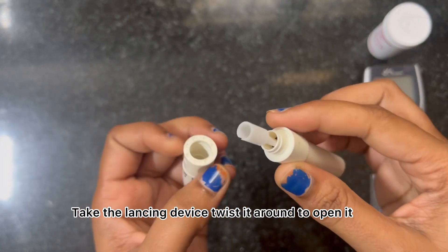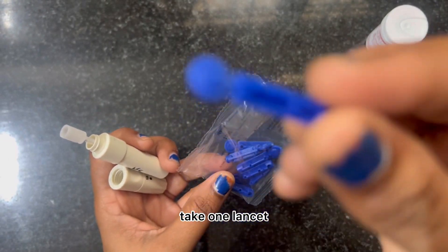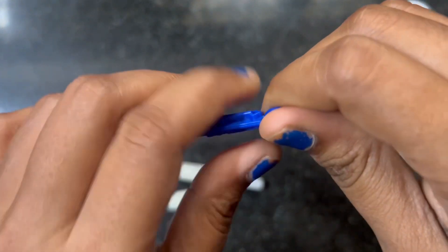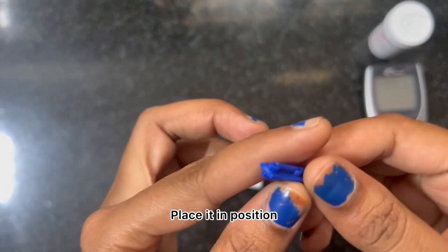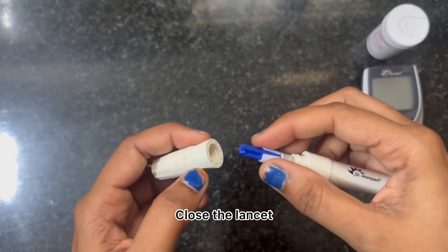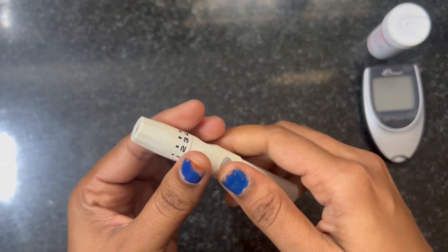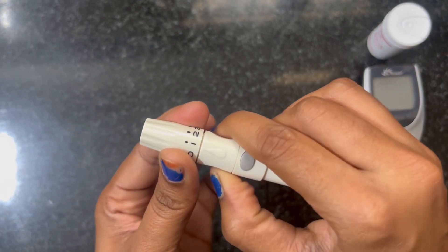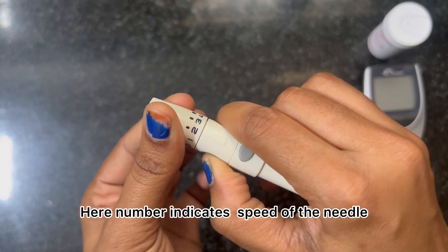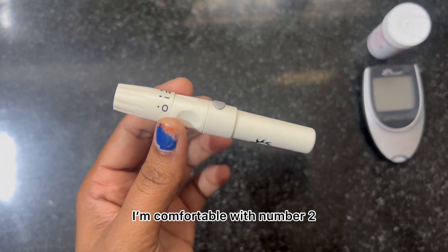Take the lancing device and twist it around to open it. Take one lancet, open the cap, and place it in position, then close the lancet. The number on the device indicates the speed of the needle — adjust it according to your skin thickness, as it varies from person to person.